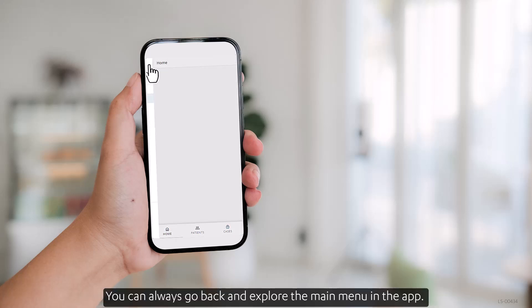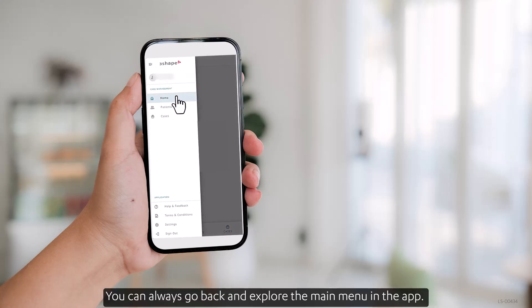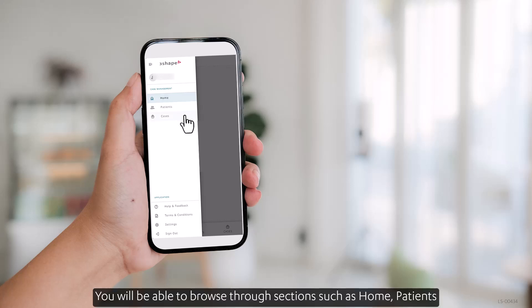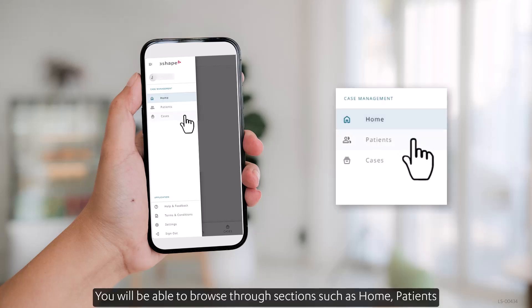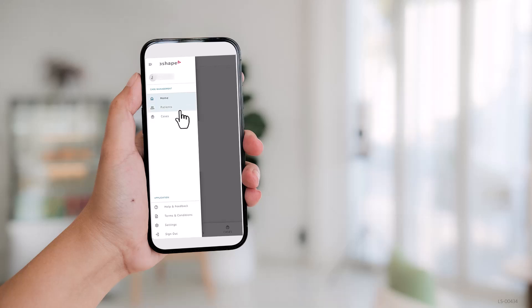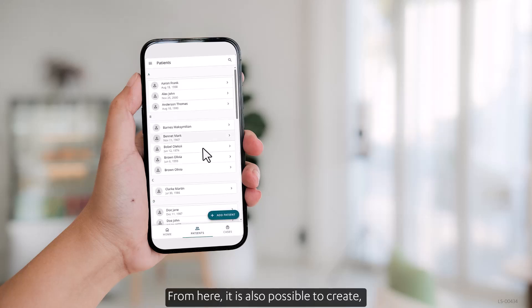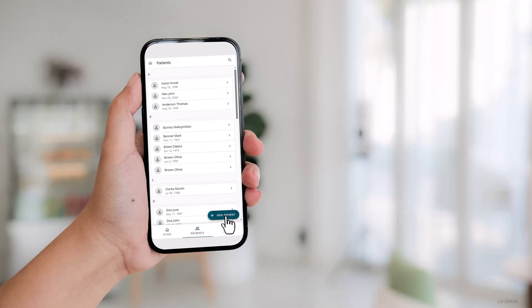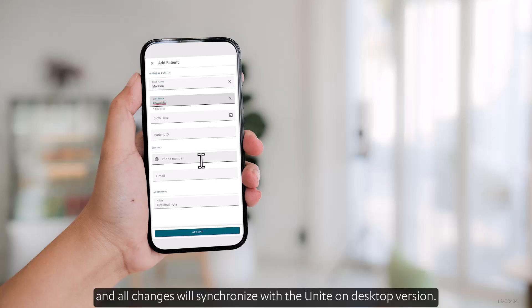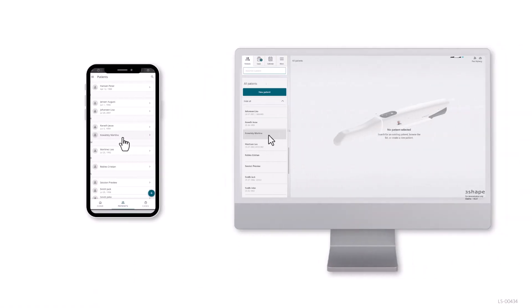You can always go back and explore the main menu in the app. You'll be able to browse through sections such as Home, Patients, and Cases, which we've already covered earlier. From here, it's also possible to create, edit, or delete a patient, and all changes will synchronize with the Unite on desktop version.